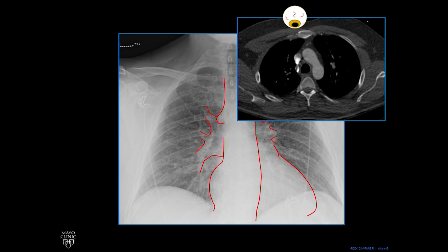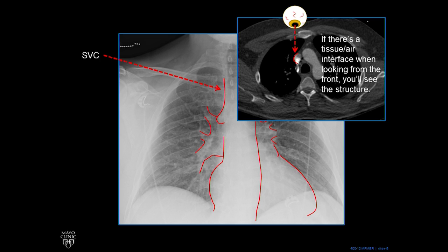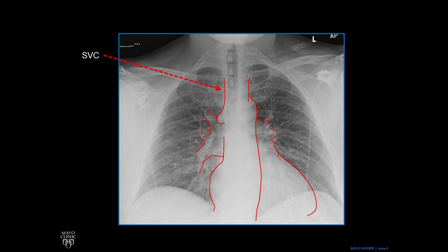There's our eye in the sky looking from the front, and we can see that bump. The reason you can see this bump — which in this case is the superior vena cava, the SVC — is if there's a tissue-air interface when you're looking from the front on a frontal radiograph, you'll see the structure. In this case, the SVC bumps against lung, and so it shows up as a line, which you can see.